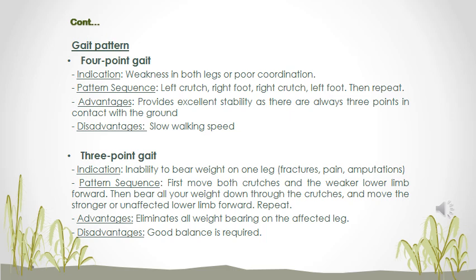Advantage of this is that it provides excellent stability, as there's always 3 points in contact with the ground while your one leg lifts up. Don't get confused here, where I told you that 4 points at a stage is in contact, just before the leg lifts off. 3 points here is just used to tell you that there's always better stability with using this gait pattern. The disadvantage is that it can be a little bit slow.